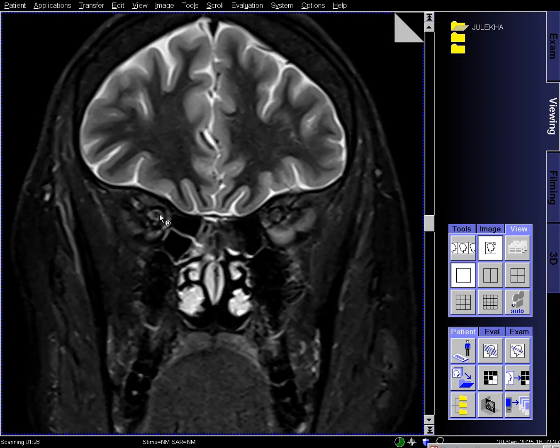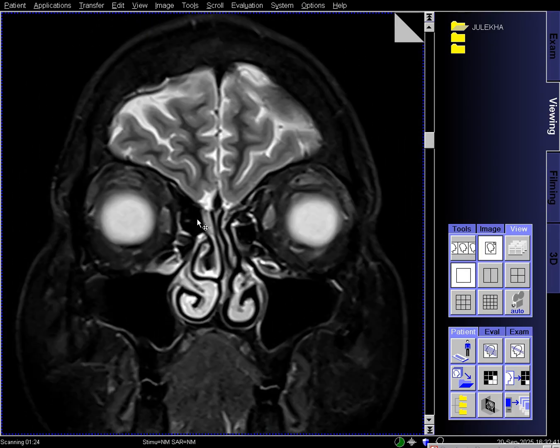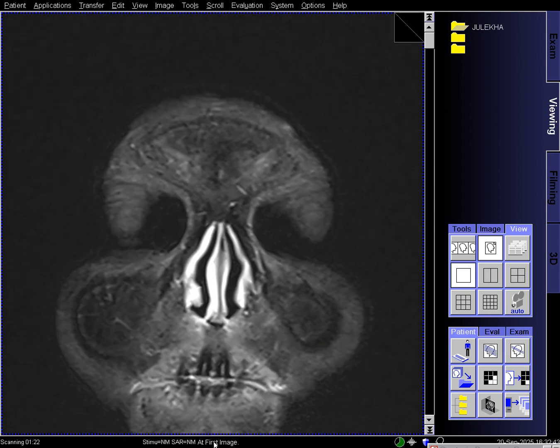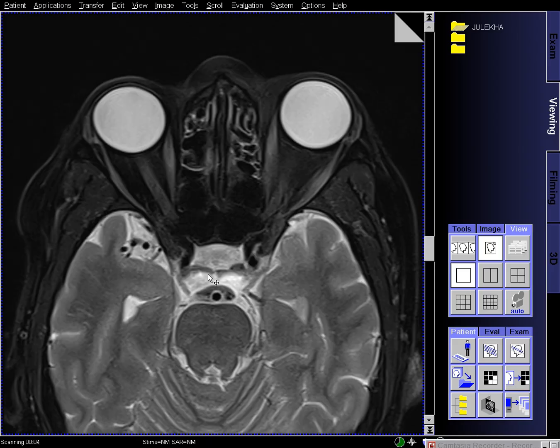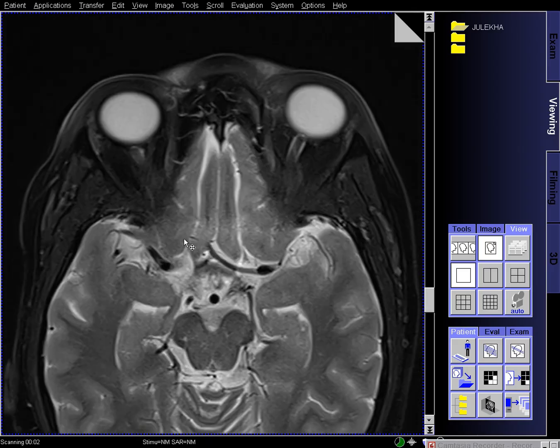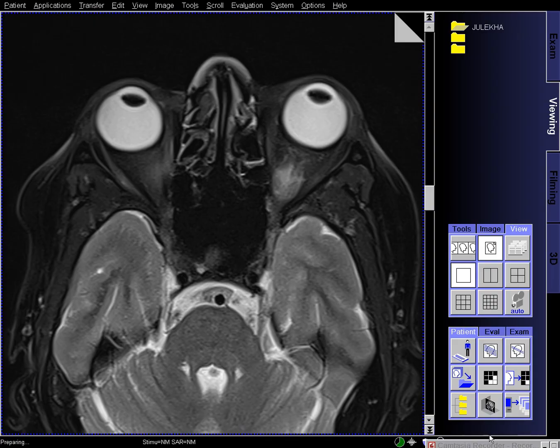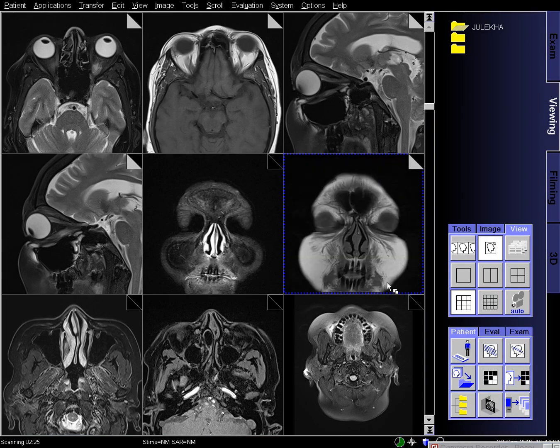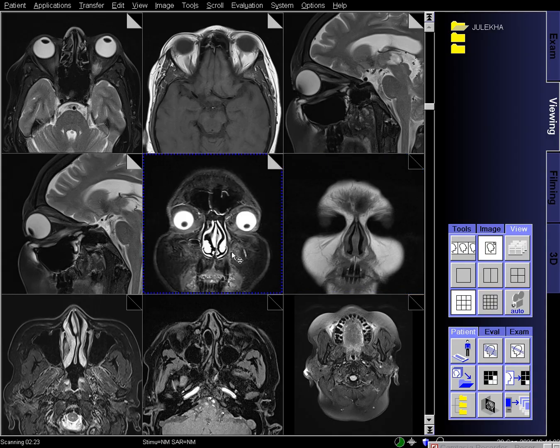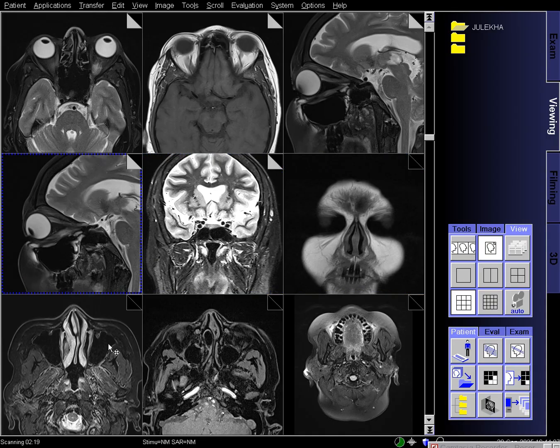Contraindications. Any electrically, magnetically, or mechanically activated implant, for example, cardiac pacemaker, insulin pump, biostimulator, neurostimulator, cochlear implant, and hearing aids. Intracranial aneurysm clips, unless made of titanium. Pregnancy, risk versus benefit ratio to be assessed. Ferromagnetic surgical clips or staples, metallic foreign body in the eye, metal shrapnel or bullet.